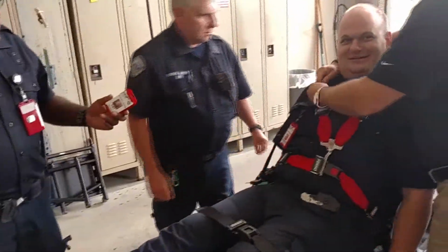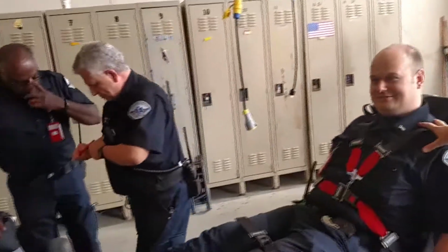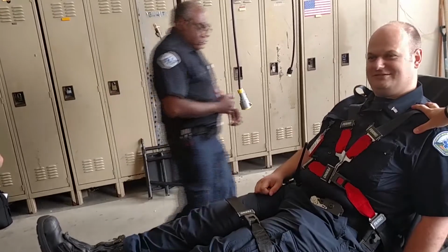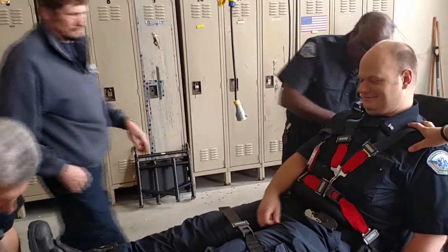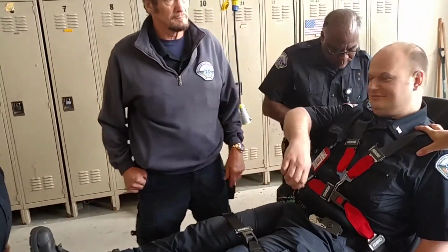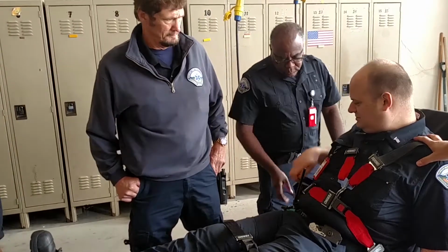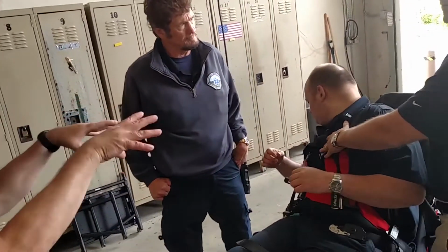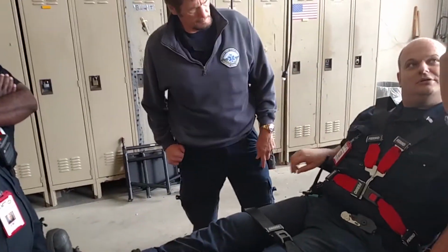So the thing about this, because as this new standard takes effect, if we were going down the road and he starts throwing up, or I've got to get access to his neck or his chest or whatever, I can still roll him around and he can throw up or do whatever he needs to do, but he's not detached from the cot. So if you get into a crash, and it's not even you, it's somebody on their cell phone or whatever, he's not going to go anywhere.